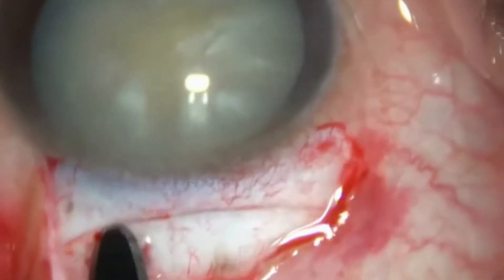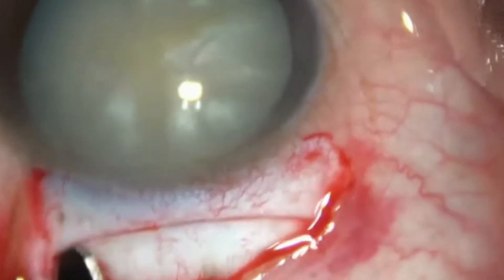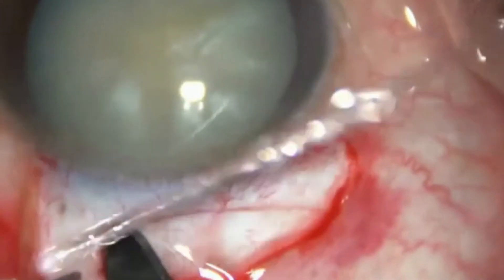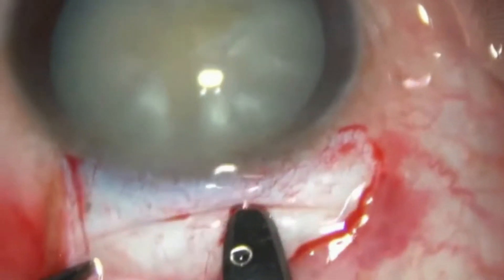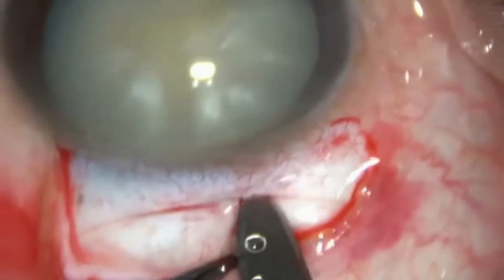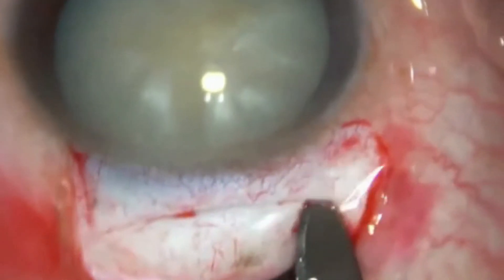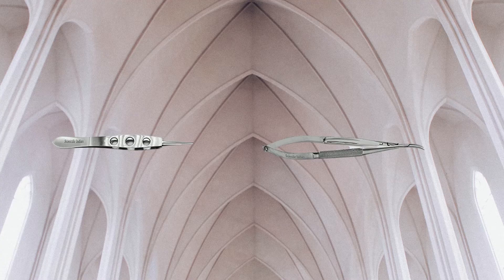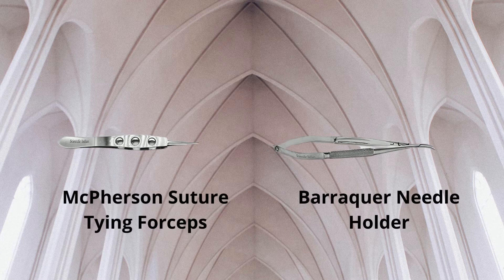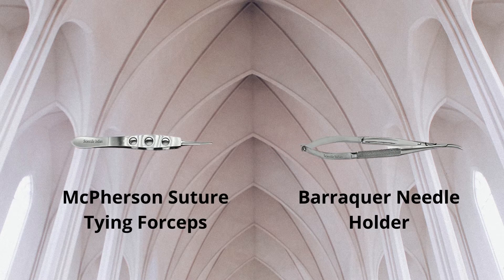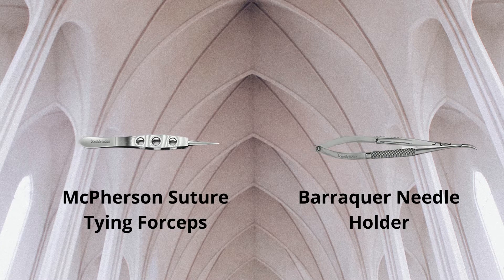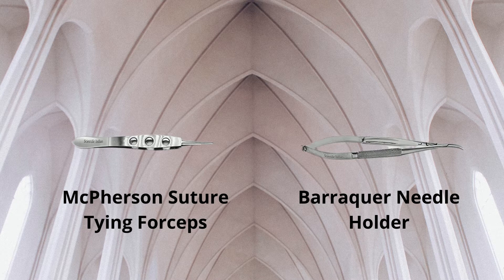However, a large tunnel need not be a problem. Even larger tunnels are self-sealing and don't need suturing if they are prepared correctly. If there is doubt about the self-sealing effect, the surgeon may apply one or two sutures at the end of surgery. McPherson suture tying forceps and Barraquer needle holder are used for suturing with 10-0 nylon suture, which, if correctly tied, will also reduce any induced astigmatism.